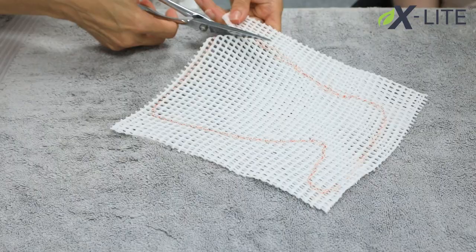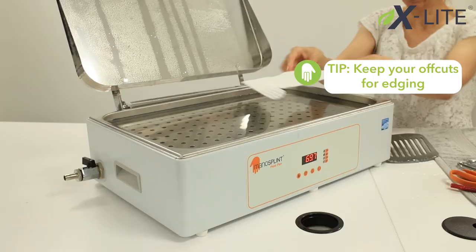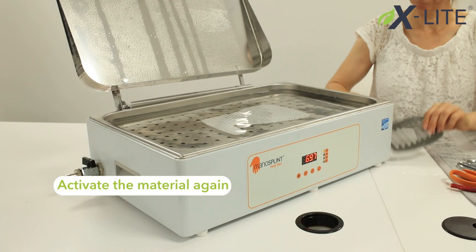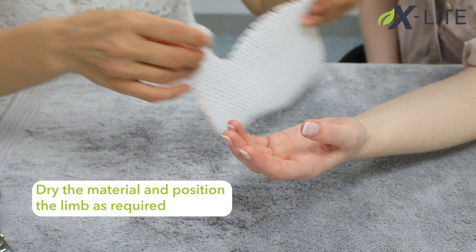Now cut out your material inside the outline. Remember to keep your offcuts for edging. Now activate the material again, then dry the material and position the limb as required.